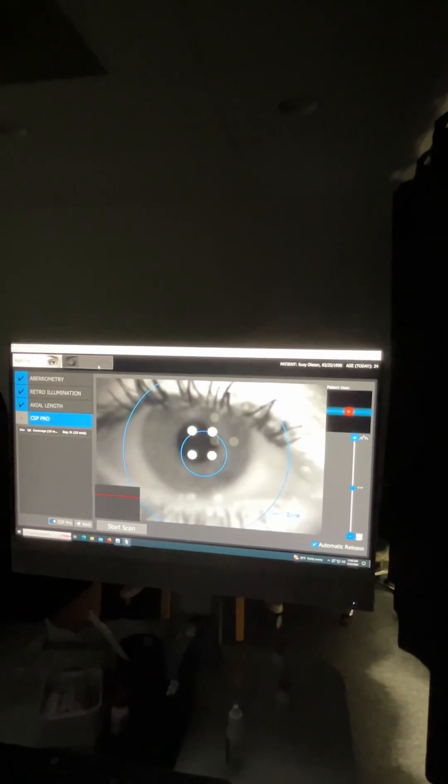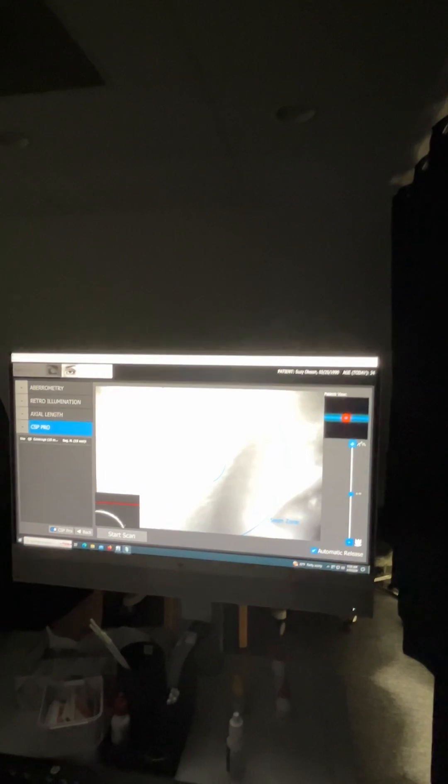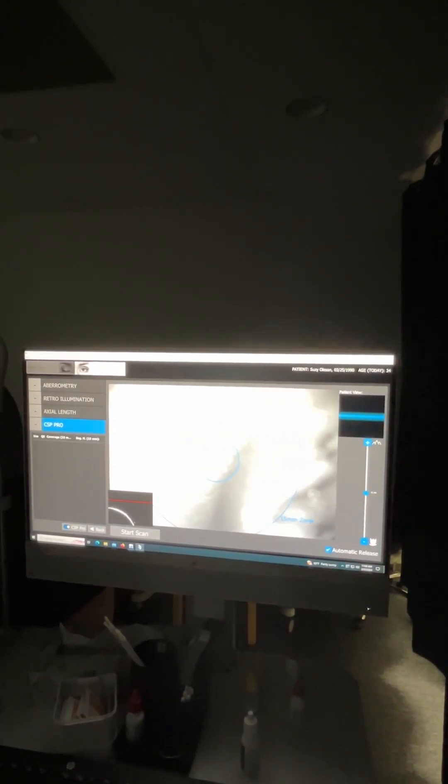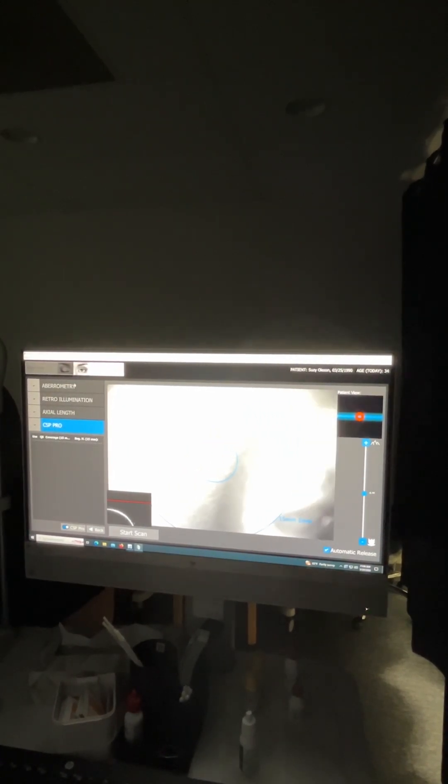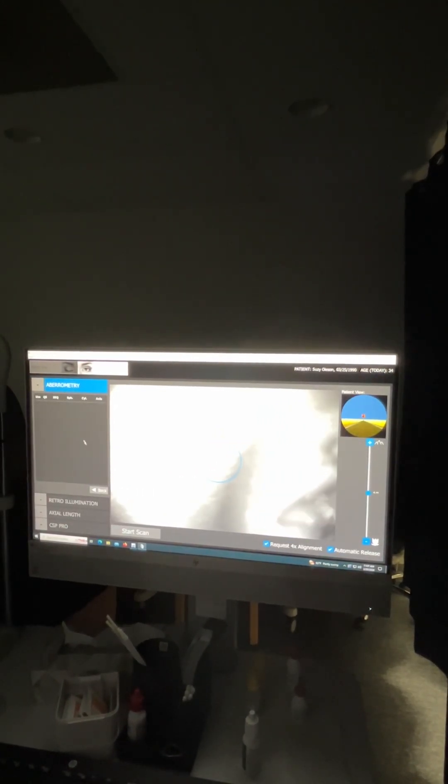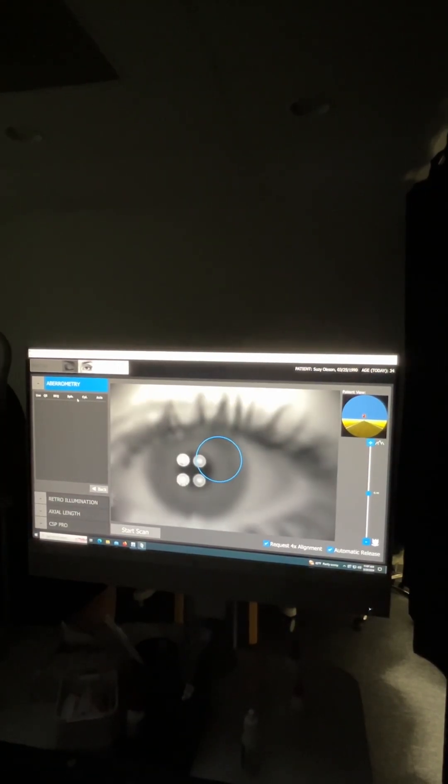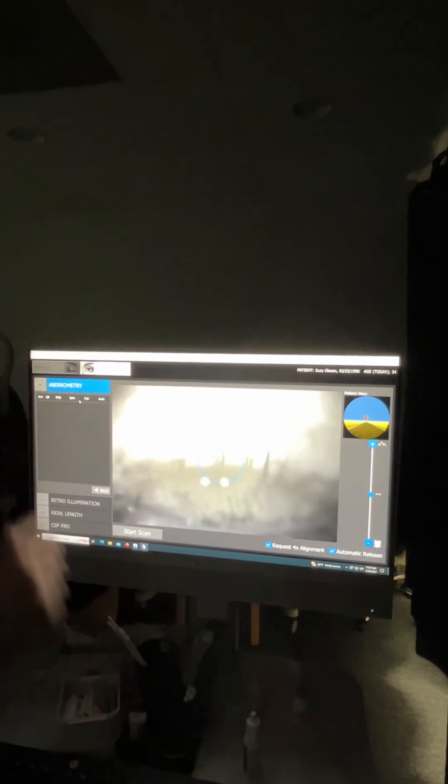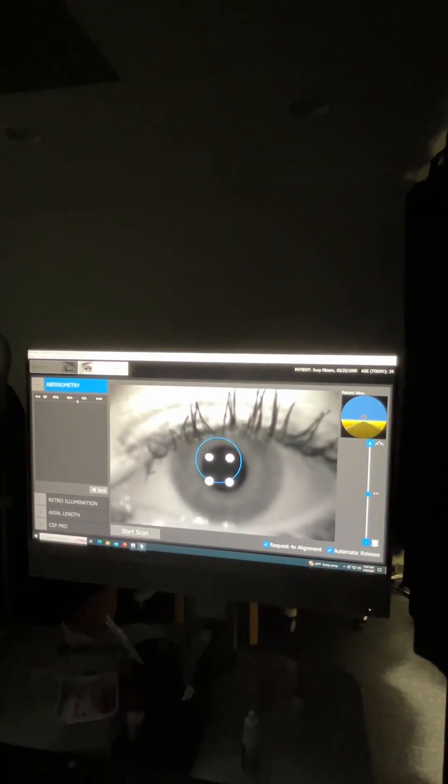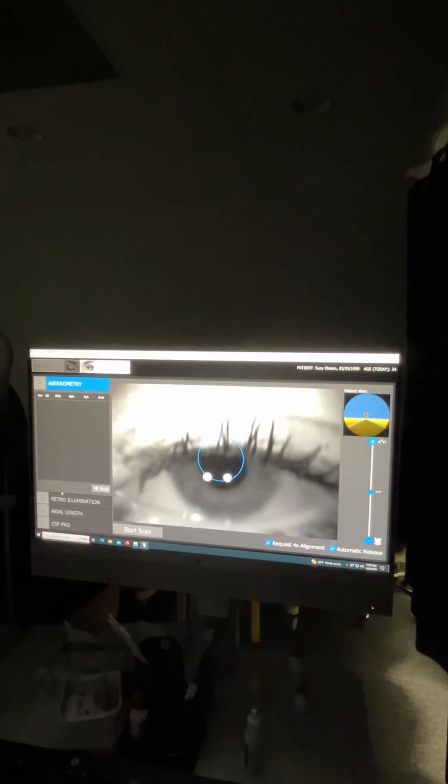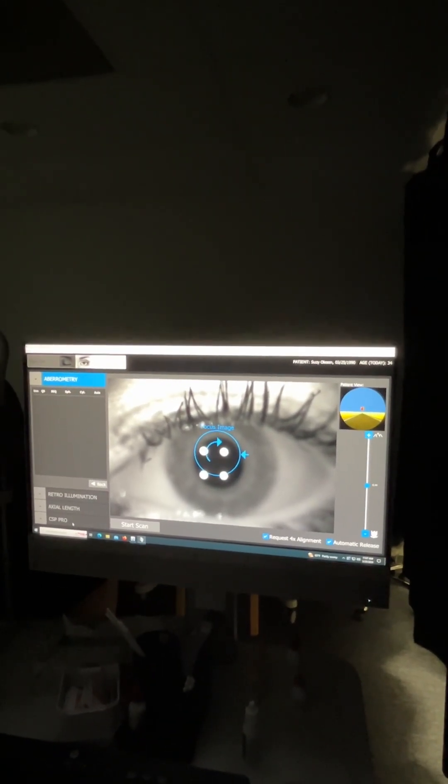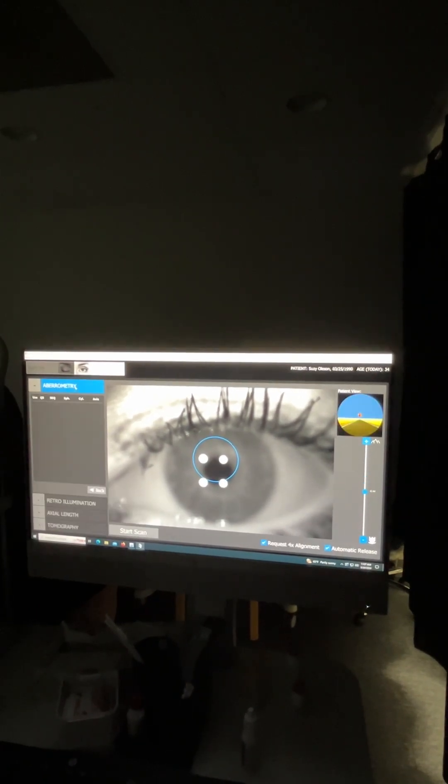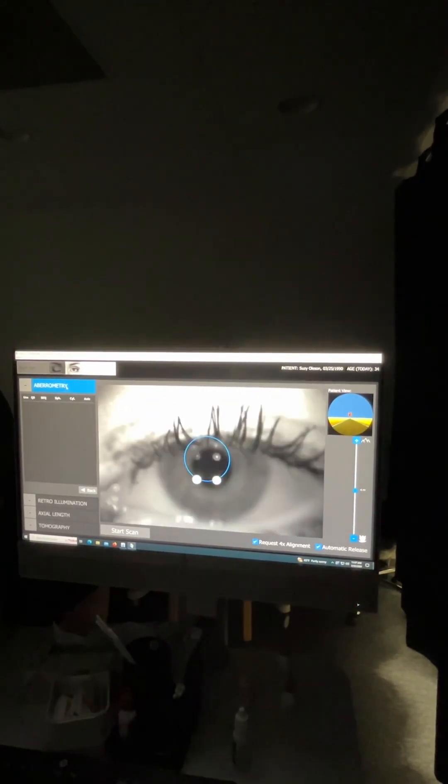Okay. Let's go and just finish up going through this with the left eye. So if you just move the instrument from the left side to the right side, the instrument already knows which eye that you're on. So we're on the left eye now. And it will automatically go back to the aberrometry. It won't make you, but it'll start at the top and go down. But if you wanted to skip that, you can always just select a different function here. So we'll go in order with the left eye.